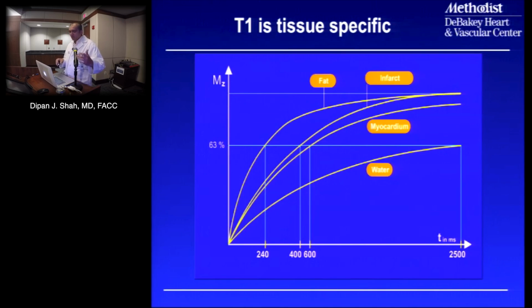And then the T1 is defined as the amount of time it takes to regrow to 63% of your resting magnetization. So if you started out at +1, you apply a 90-degree pulse to drive the magnetization to the transverse plane so that there's 0 longitudinal magnetization. The amount of time that it takes for you to get back to 63%, that defines your T1 time.